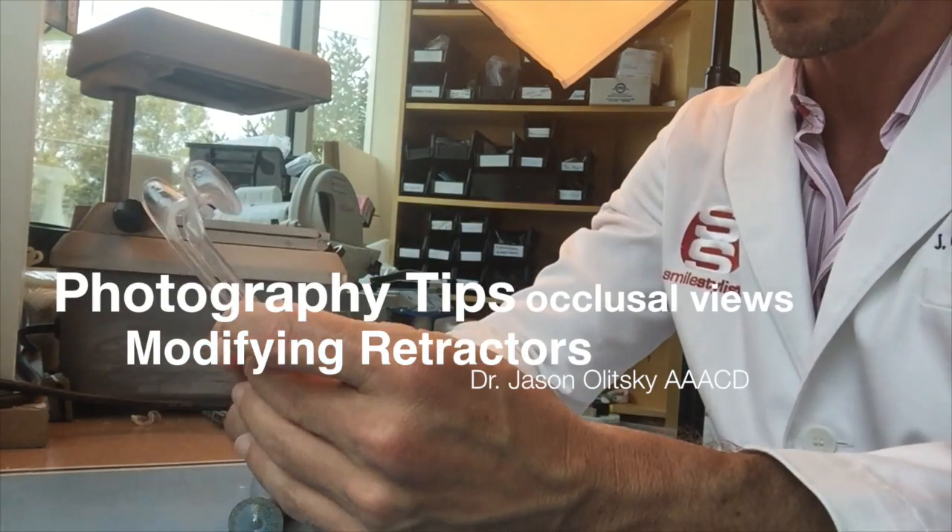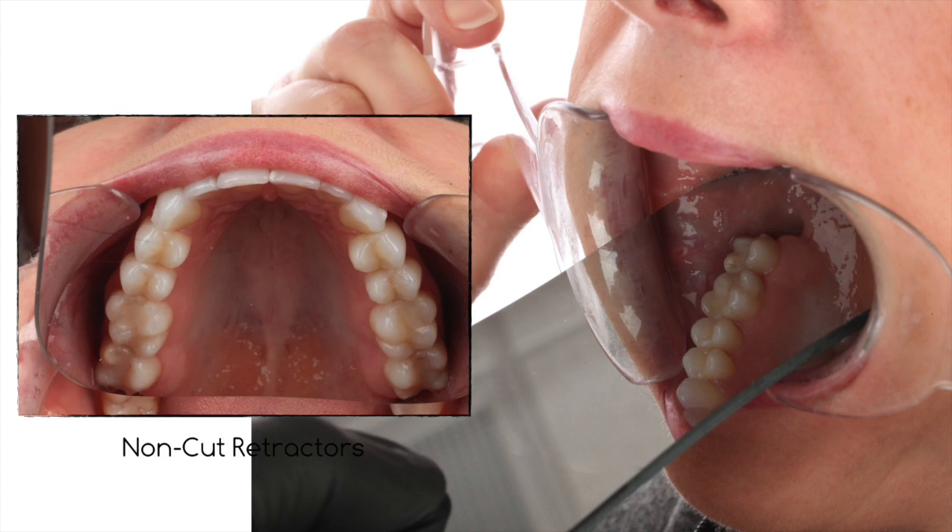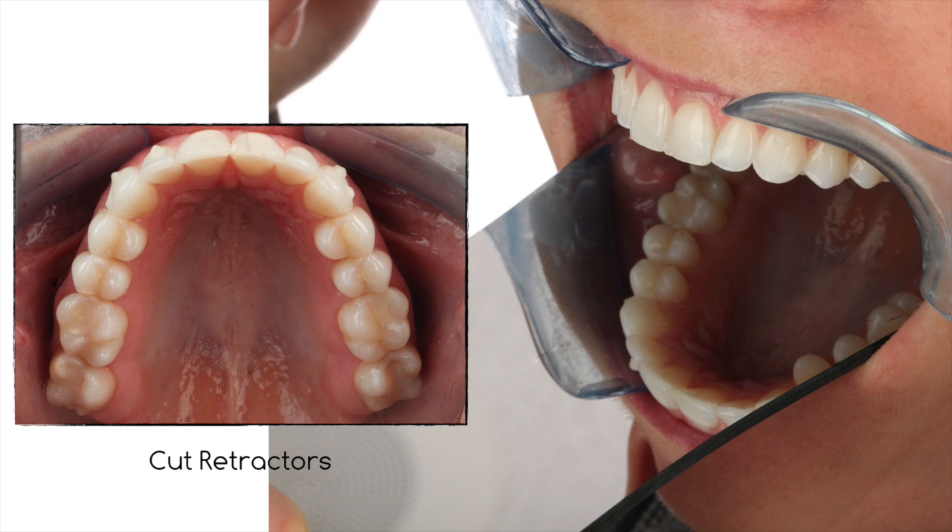I talk about cutting retractors to make occlusal views easier to capture, because the retractors get in the way of capturing the most ideal occlusal view in a lot of patients.